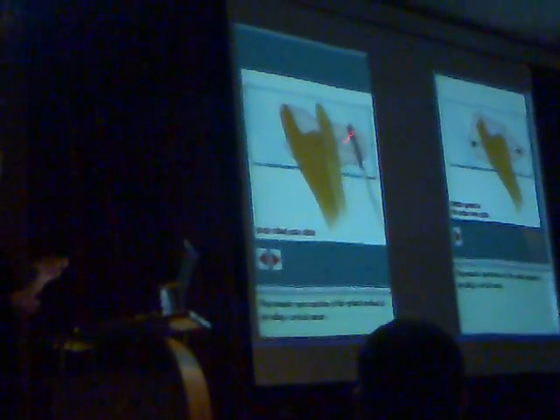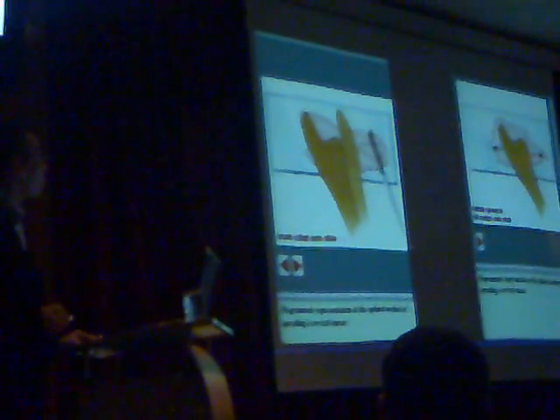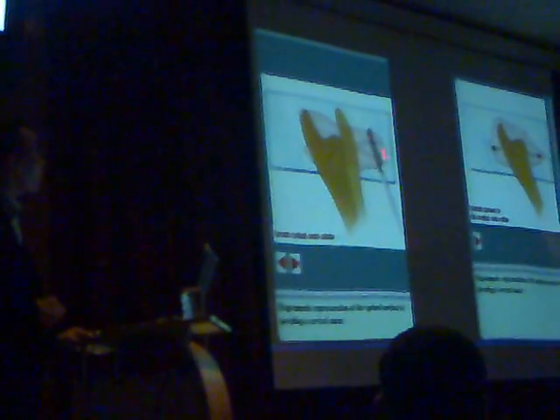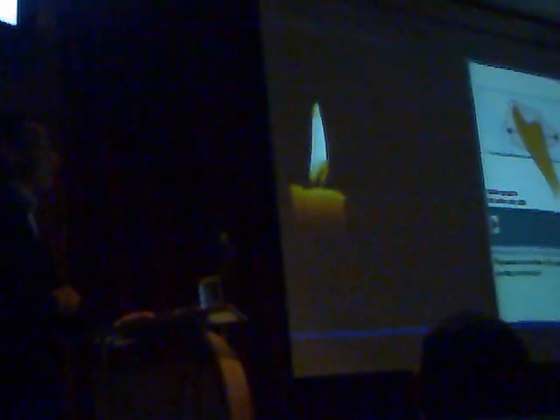Regarding spreading, there is a certain technique. From the spatula, use a smooth movement from side to side, not up and down, because this disturbs the sample. Smooth from here to here and from here to here. Regarding the brush, it is rolled on the slide. If we do it like this, what are the results?